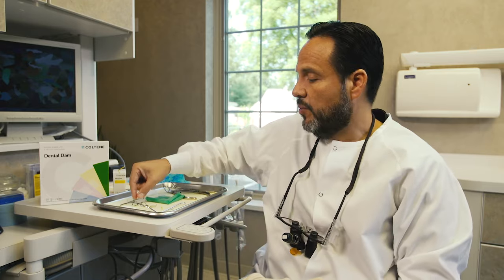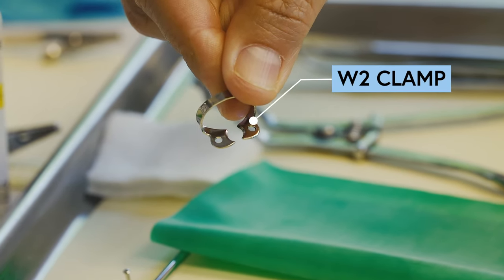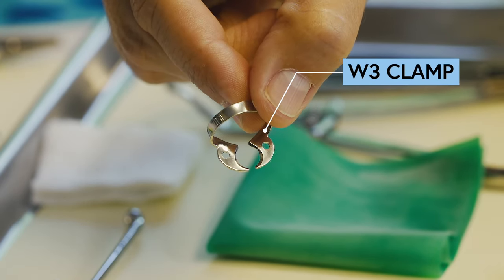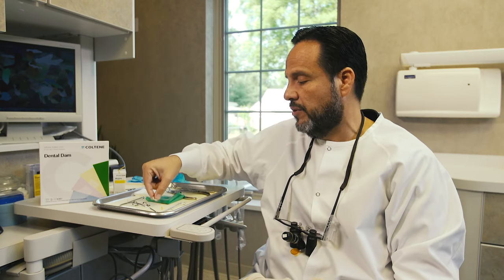We're going to start reviewing our basic armamentarium for a rubber dam isolation. I'm going to start out with showing you the W2 clamp for pre-molars, the W3 clamp for molars, and the W8A clamp that I normally use for molars that are slightly broken down and that I don't have a lot of room to engage the jaws of the clamp towards the molar.